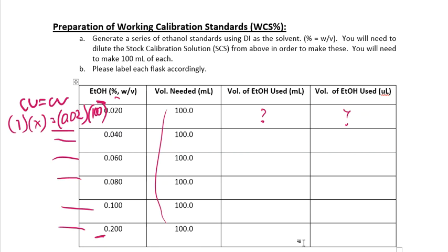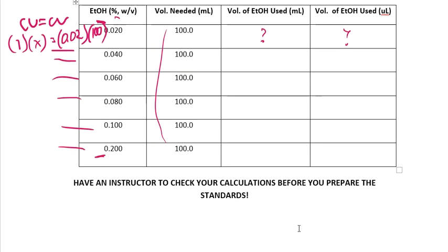Once you do the math, we don't want you to just do it. We actually want you to check your calculations with us, so that we can check off on those and make sure that you are doing the proper standard prep. In other words, we don't want you to waste your time and go back and do it all over again, because you probably don't have time to go back and do it all over again.